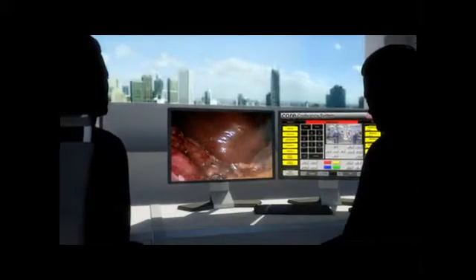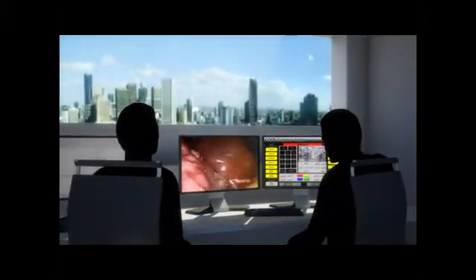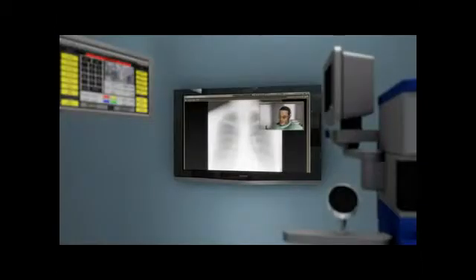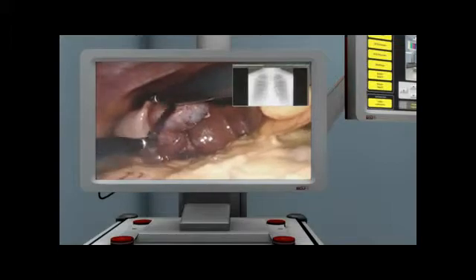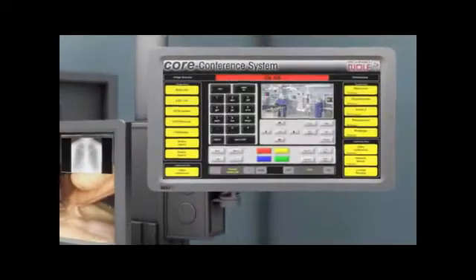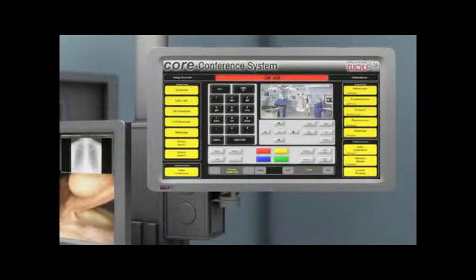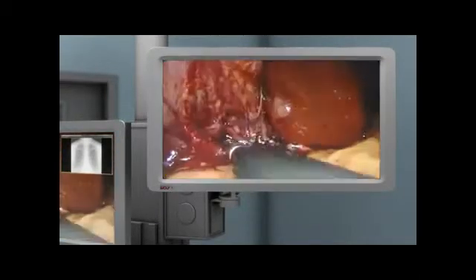Images of the current operation can be made accessible by live stream, even at locations outside the operating theatre — worldwide. A video conference system can be used for this purpose. A video conference in an operating theatre? Of course. For example, the surgeon can consult a colleague during an operation and send images. Or students can follow the operation without actually being in the operating theatre themselves.